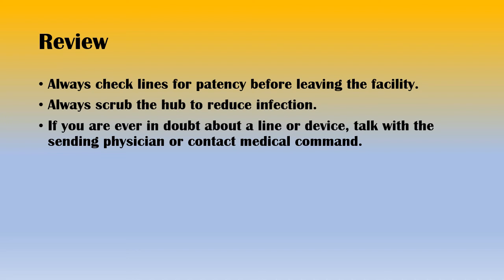Always scrub the hub to reduce infection. We should be doing this on peripheral lines also. I know we don't always do it, but anytime you put something in an IV, you should be scrubbing the hub. If you're ever in doubt about a line or device, talk with the sending physician or consult medical command.